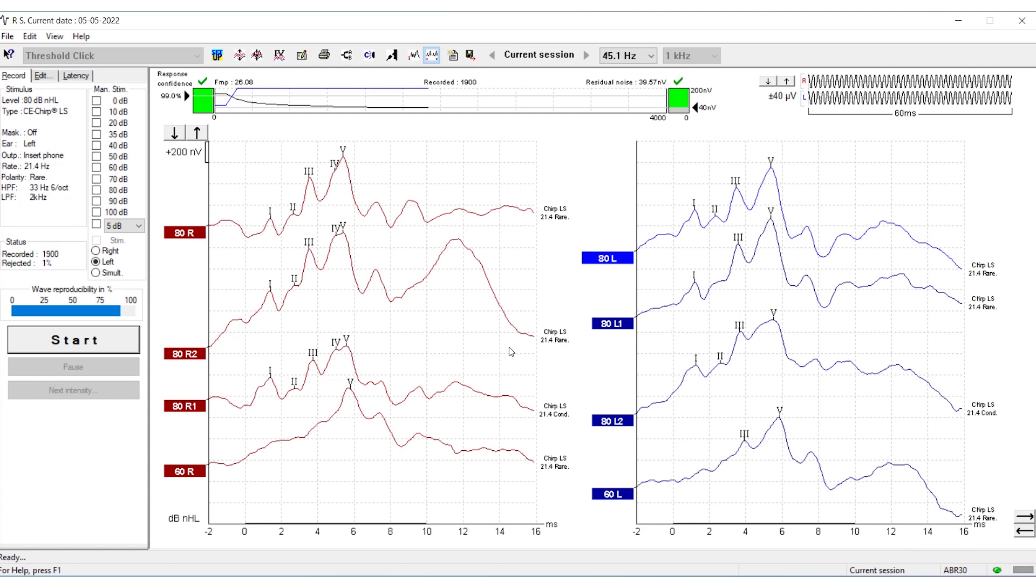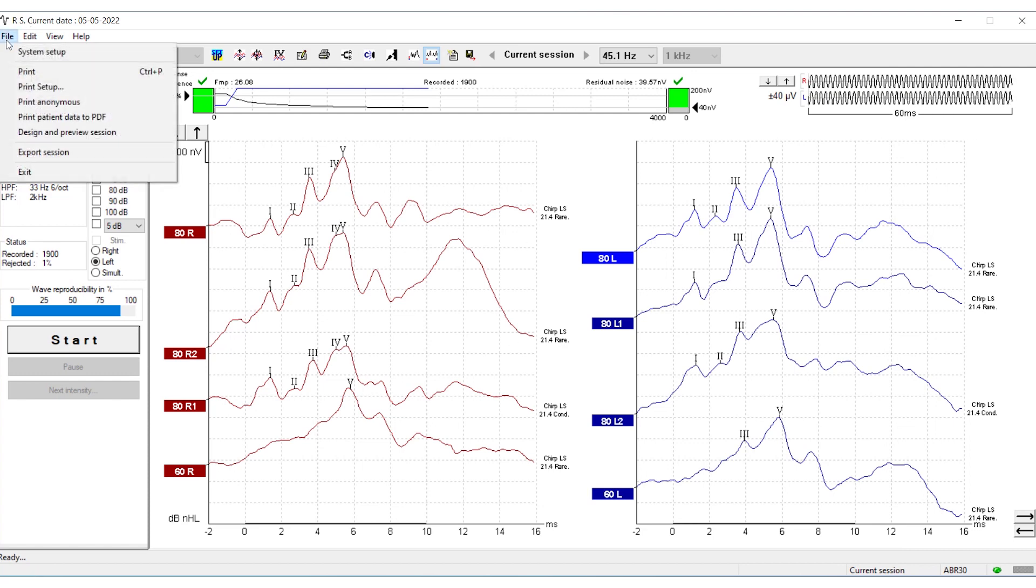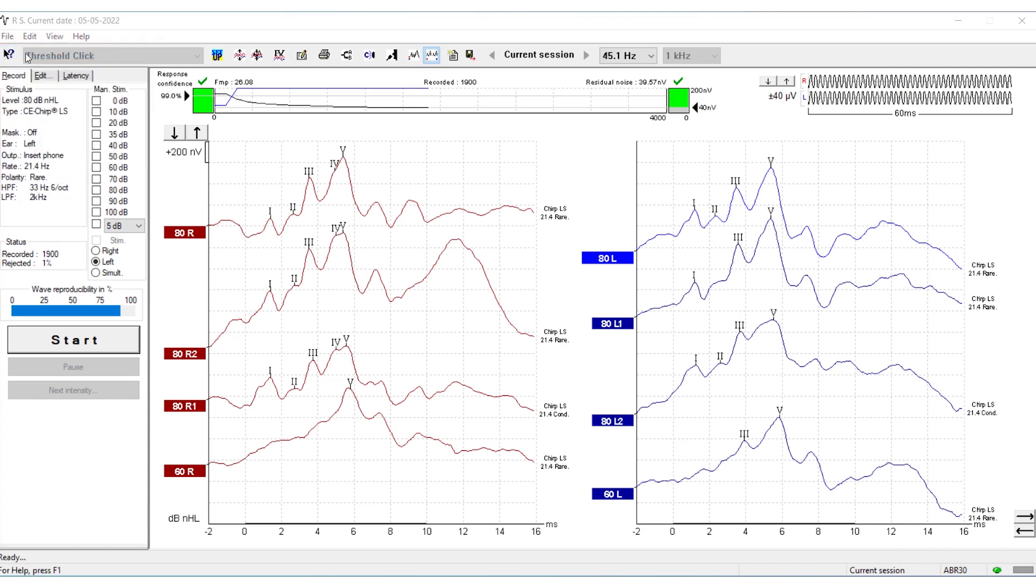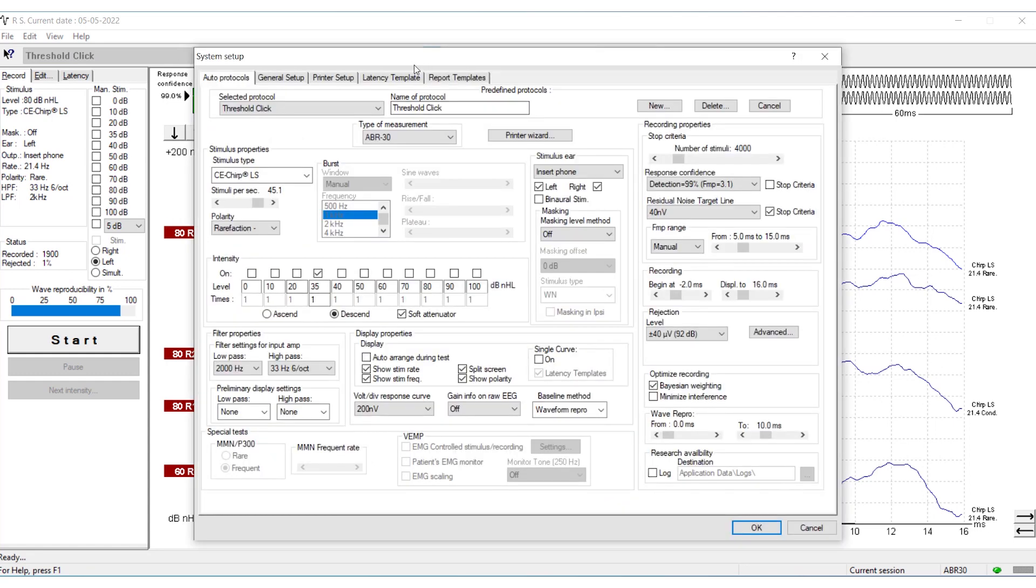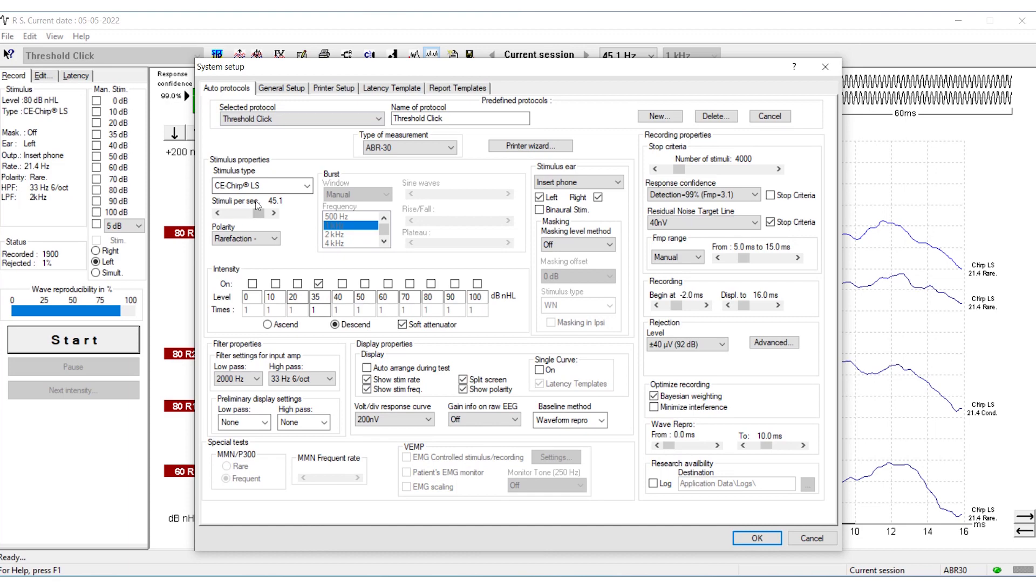Remember to change the protocol name. If you go back to System Setup, you can see that you have changed the stimulus to CE Chirp permanently in that protocol.